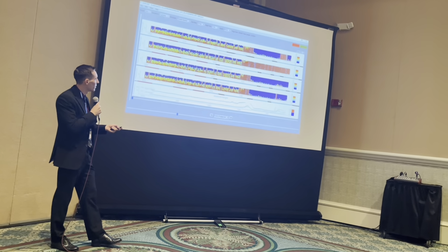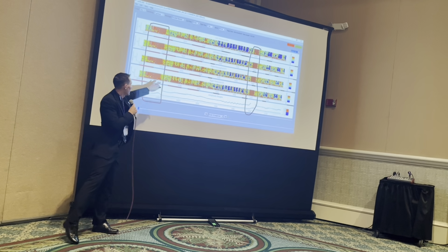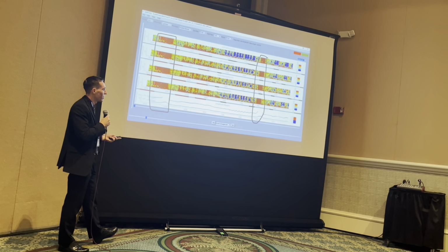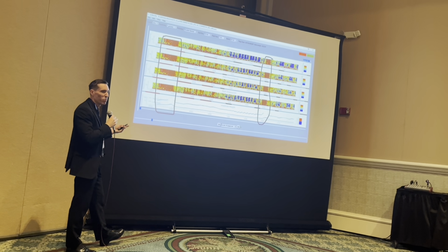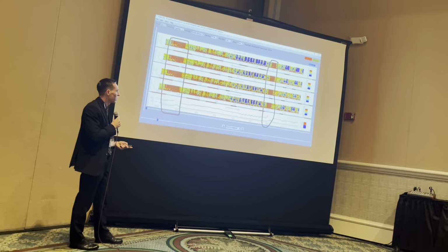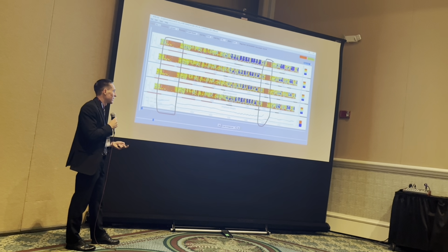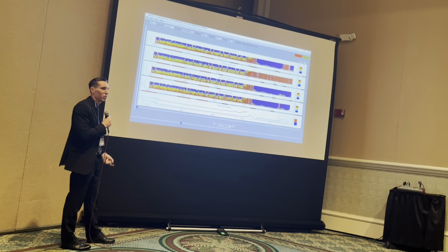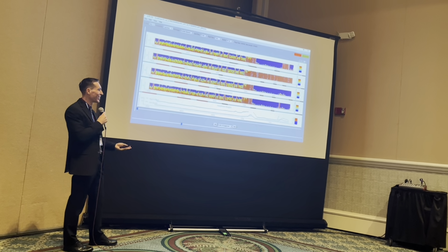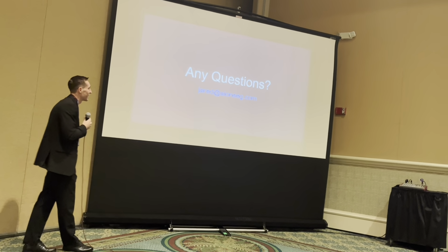For example, say a nurse was looking at this and they saw all these flames. They might think they're having epileptic seizures and all that, but it's usually just going to be a lot of artifacts. So I think it'd be difficult to teach nurses how to do this, and it'd be nice, but I don't know if we can. It takes our expertise and our knowledge as EEG techs, I think, to really understand this.